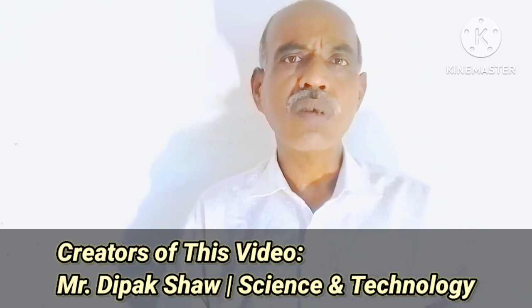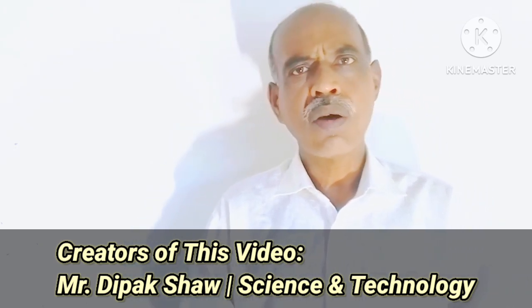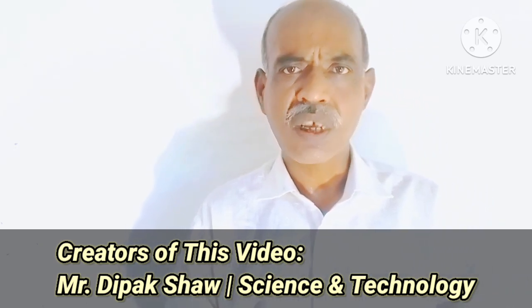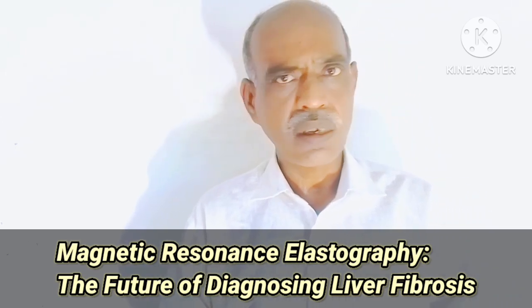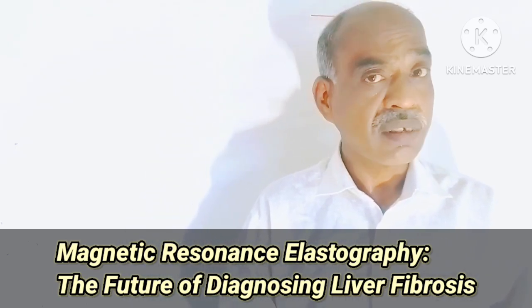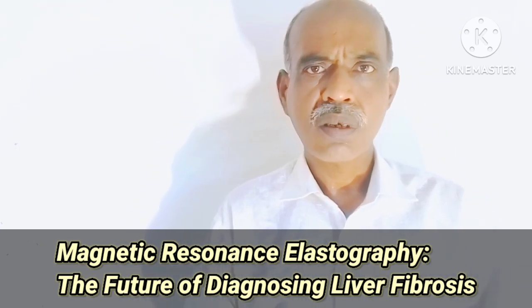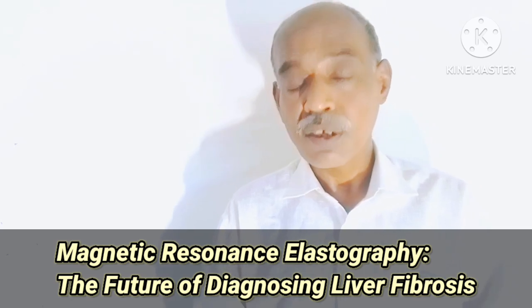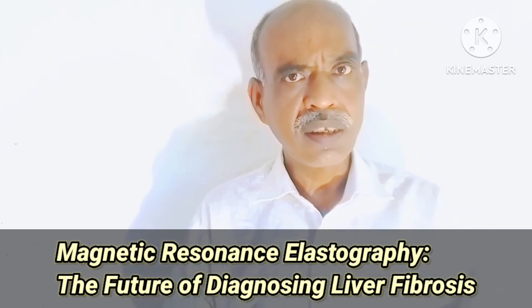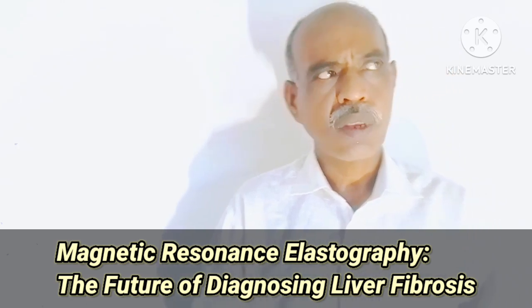Sound waves act very well for superficial tissues. But for the tissues which are deep inside our body, since sound waves cannot penetrate very well, so there is a problem with sound waves. And especially for obese patients, this problem becomes higher.